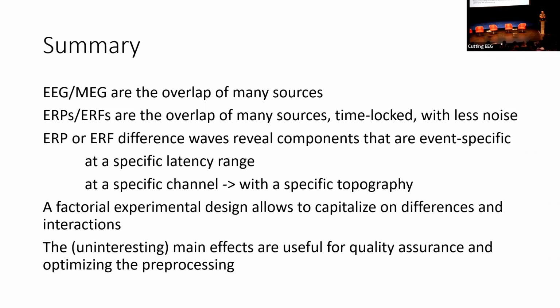That's a very interesting question. So the assumption that we're making in the computation of ERPs is that the response is identical over trials. At least the thing that we're going to get out is that part which is identical over trials. But of course, over trials, our participant is not always going to respond exactly the same way in each of the trials. So over trials, there is going to be variance that is related to the brain activity.